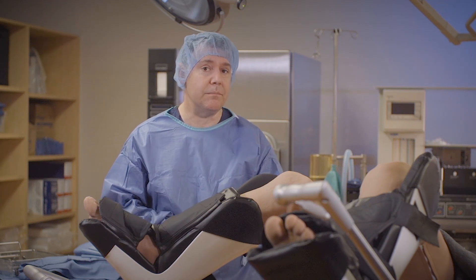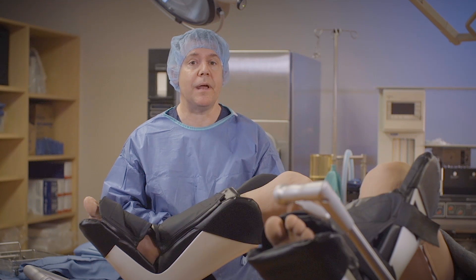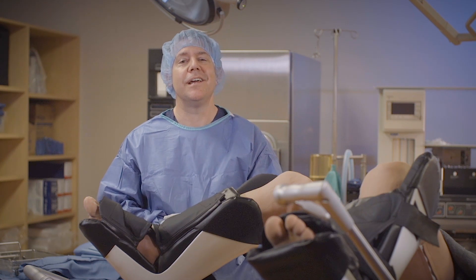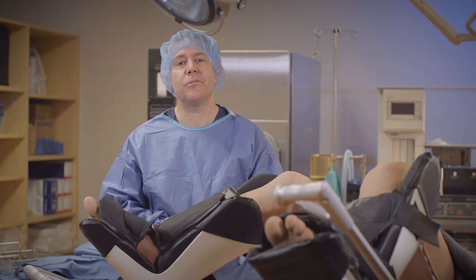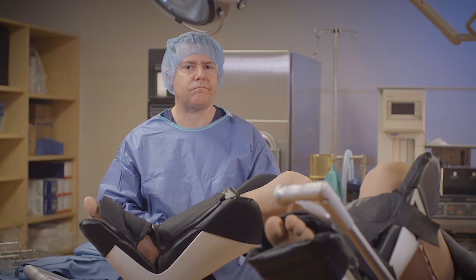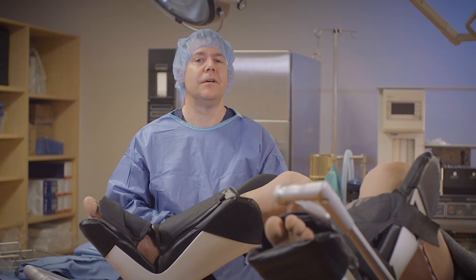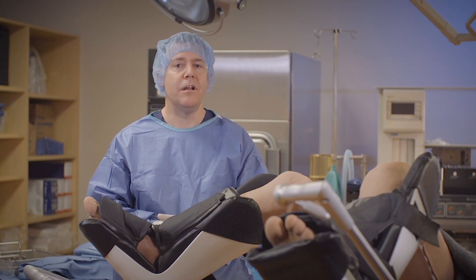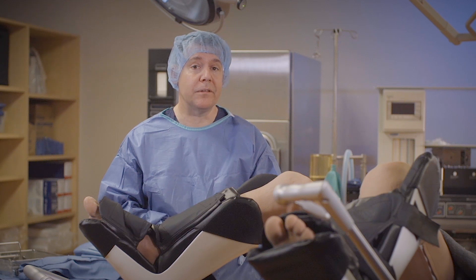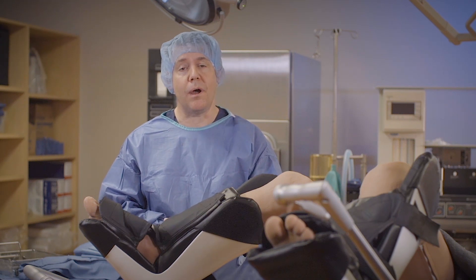First let's talk about those unique drapes. The first two drapes that are pretty unique are the under buttocks drape and the leggings drapes. These drapes have put fear into the hearts of many a student and new employee, but with a couple of practices we can overcome our anxiety. We also have towels, medium sheets, and a fenestrated drape. There are many fenestrated drapes specific to lithotomy position, but as I don't possess one in the lab I'm stuck with a regular laparotomy drape.